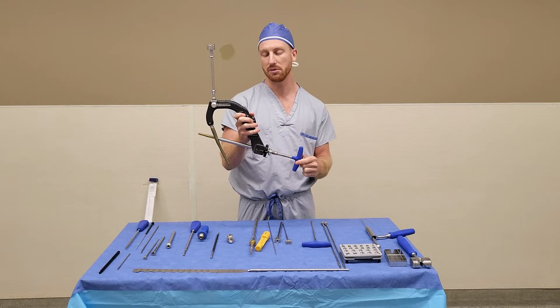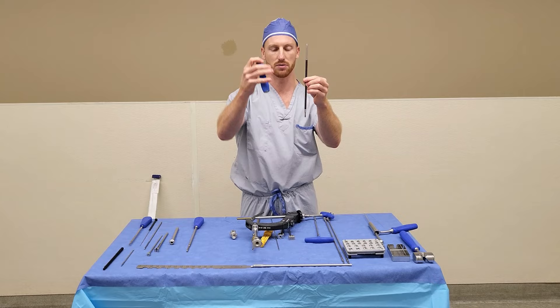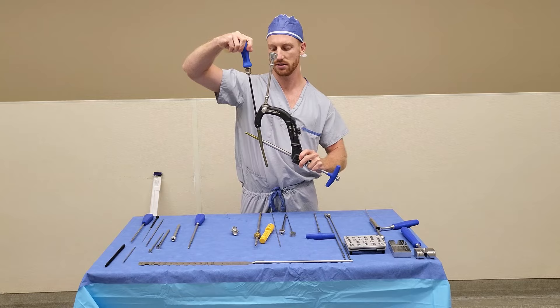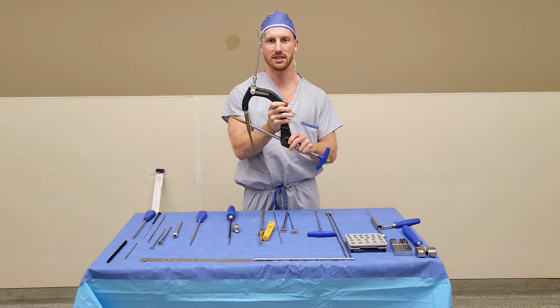Once the surgeon is happy with the placement, you will then lock the leg screw into the nail. To do this, you need to assemble the torque limiting screwdriver, which is the black shaft with the blue handle. Once assembled, this can be fed into the top of the nail and turned until you hear an audible click. I promise it clicks. Once it's clicked, you have locked in the leg screw and you're ready for distal locking.